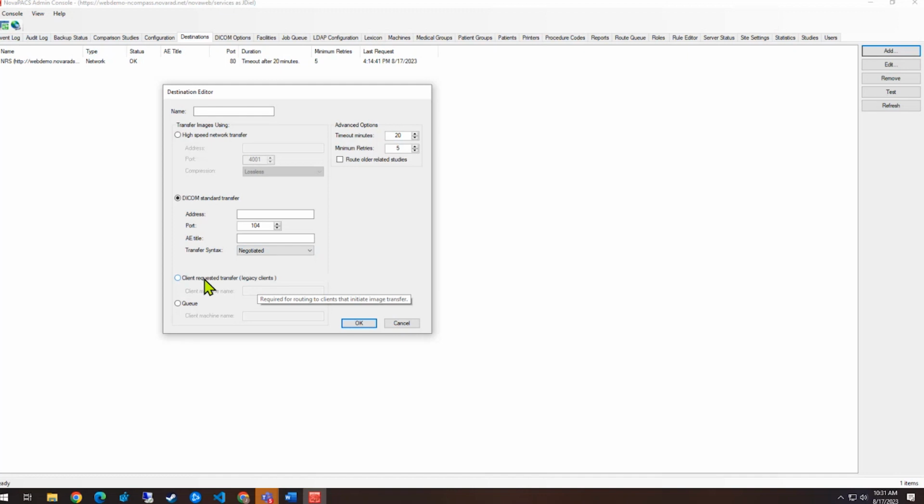It's an older technology. Queue routing is actually one that a lot of people might benefit from, but they may not fully understand how it works. So what queue routing does is it essentially sets up a route queue in the system for a distant end system that it can't talk to yet, or it may not always be online. And you can even do this with the click once viewer. It does not have to be a managed viewer.